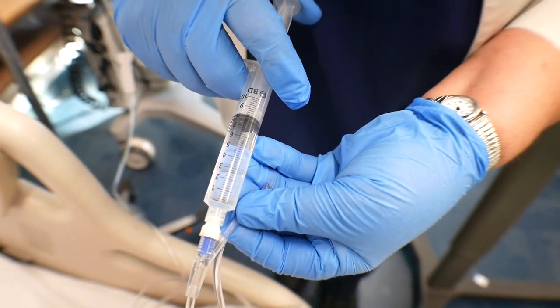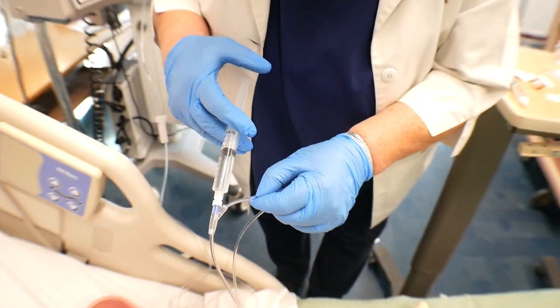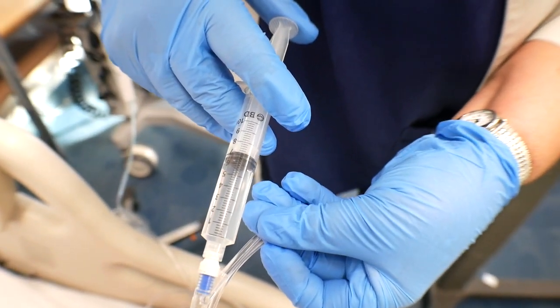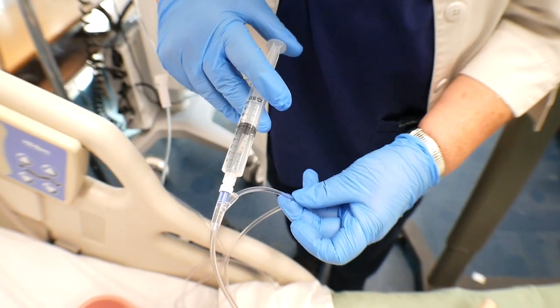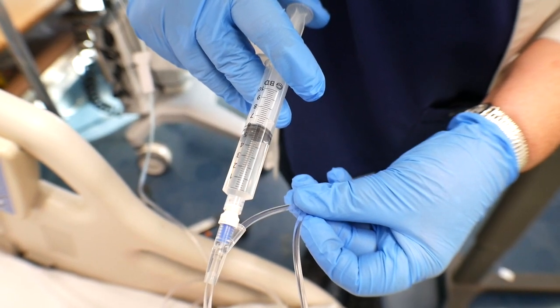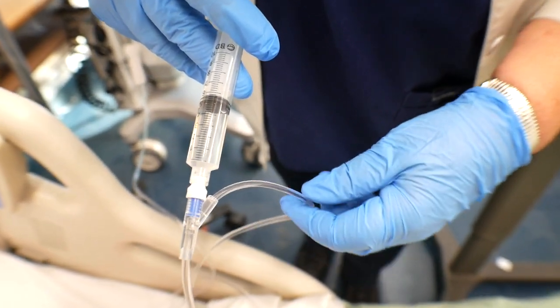1, 2, 3, 4, 5, 6, 7, 8, 9, 10. Unclamp it. 1, 2, 3, 4, 5. I'm counting through the cycle again: 10 seconds clamped, then 5 unclamped. A little behind.